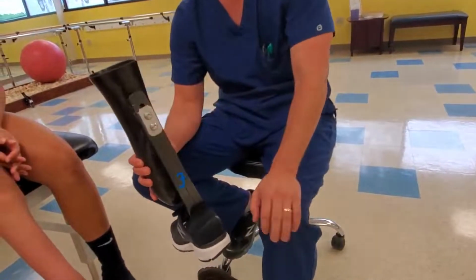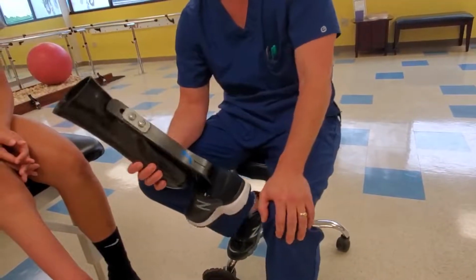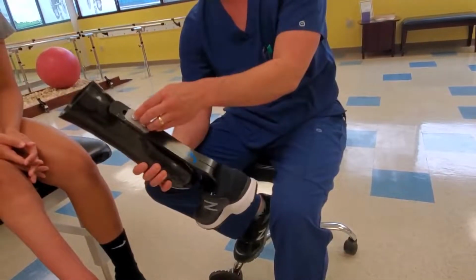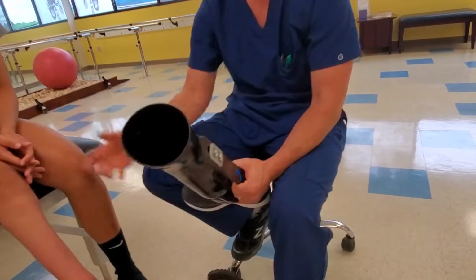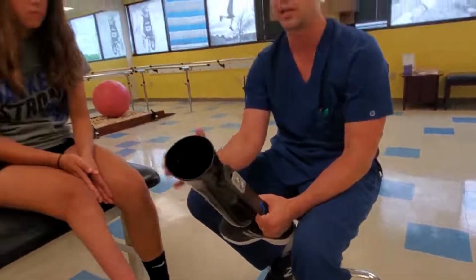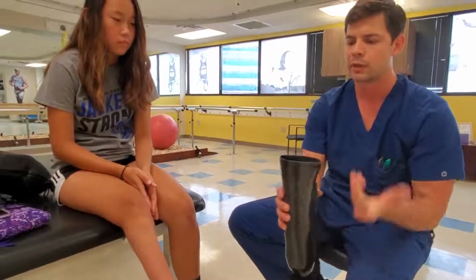We can adjust the height bracket to her current height changes, but same foot, new bumper, and then the adjustability of the bracket allows us to keep everything the same. All we had to do was unscrew the socket from the foot, make a new socket, and realign it on here. So that's what we have today.